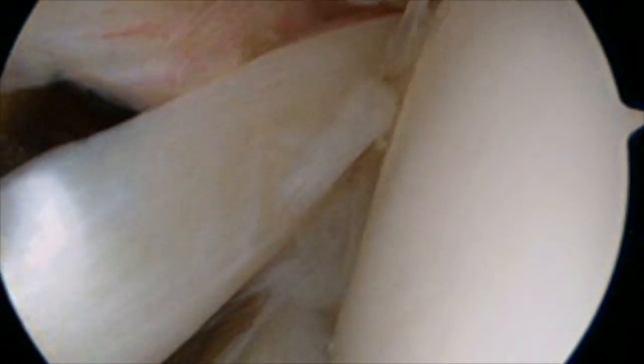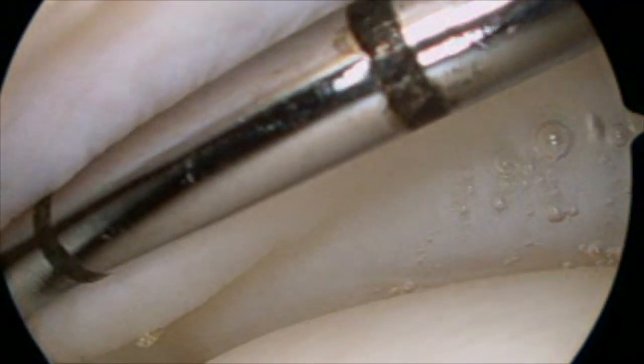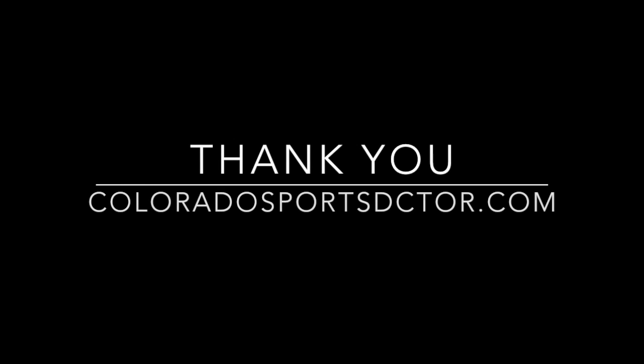So after evaluating the biceps, the next thing you do is look up at the rotator cuff. This is the joint cartilage on the humeral head — rotator cuff. We're lifting that up with the probe. And this is a normal rotator cuff attachment site. So that was basically a tour through a fairly normal shoulder.